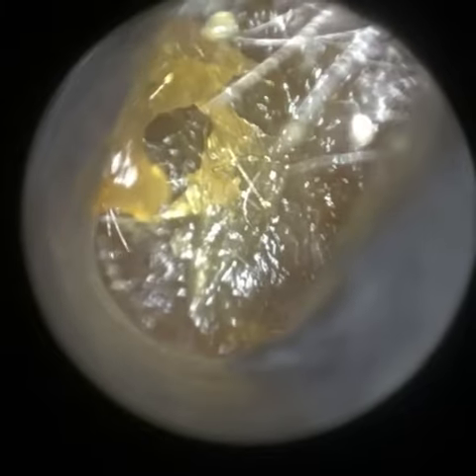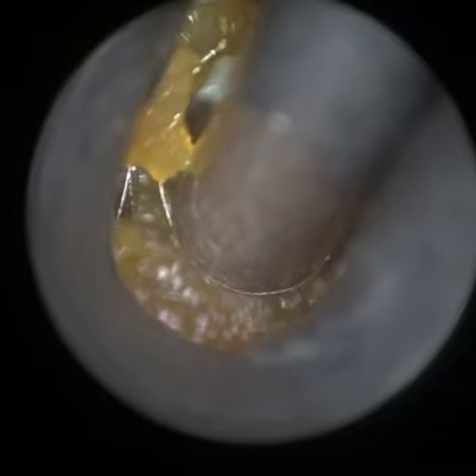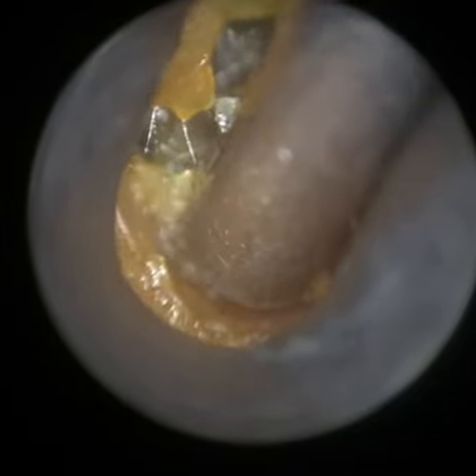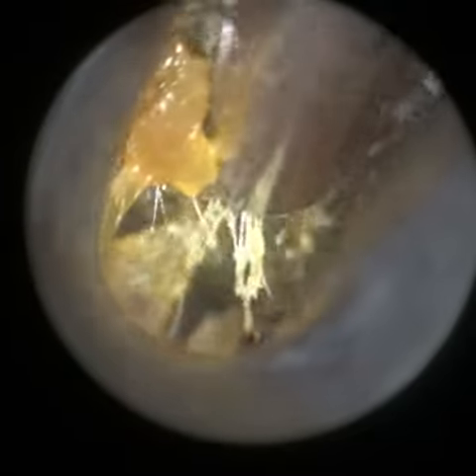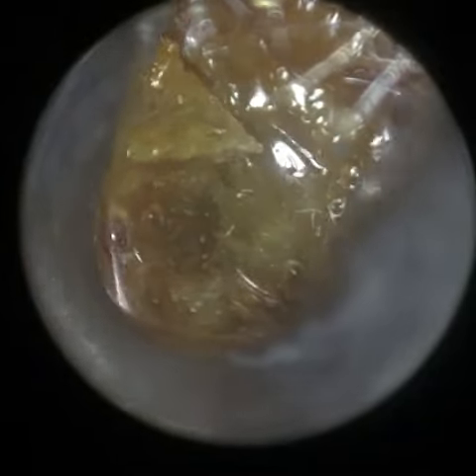We're now going to the patient's right ear. Once more I'm using our smaller speculum. This smaller size is going to be used for patients with narrow, bendy ear canals and also pediatric patients. The 4.25mm speculum, I feel, is going to be the most commonly used one — it's the one that I use most commonly in my clinic.